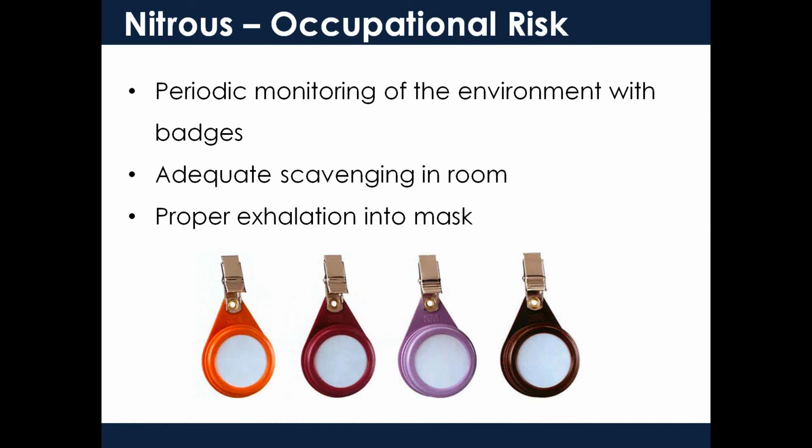And then, of course, there's another group, the ACGIH, which is the American Conference of Governmental Industrial Hygienists. They say that it needs to be 50 ppm or less. We really default to the NIOSH, and the vast majority of the hospitals that are using the Pro-Nox are testing when they start and then about every 6 months, because that was another question, how often do they do it? And then one of the other questions was, do the nurses always wear a badge when caring for a patient on nitrous? It's just periodic that happens. Some hospital policies do it every 3 months. I've seen every 6 months, and I've seen policies with every year. So it kind of defaults to your biomed and how your facilities group wants to handle that. We would recommend at least every 6 months, just to make sure your system's in check, because things happen.